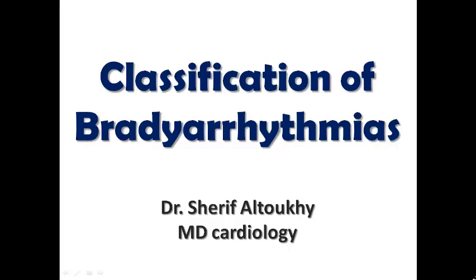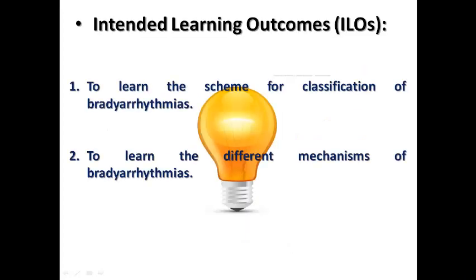And today, our lecture is classification of bradyarrhythmia, which is an important preamble before going in depth with the bradyarrhythmia as the sinus node dysfunction and AV blocks. Of course, bradyarrhythmia is one of the very common situations that we see in the ER, and so today we need to learn the scheme for classification of bradyarrhythmia in order not to interpret any ECG as just bradycardia without identifying the specific cause of this bradycardia and to learn the different mechanisms of bradyarrhythmia.